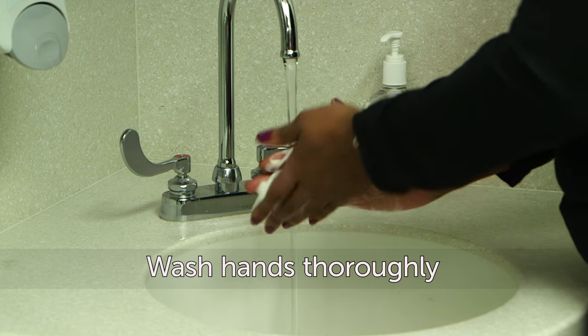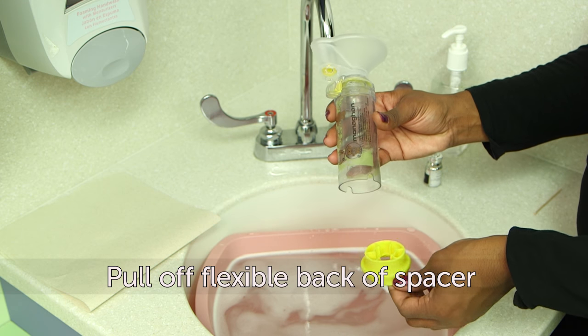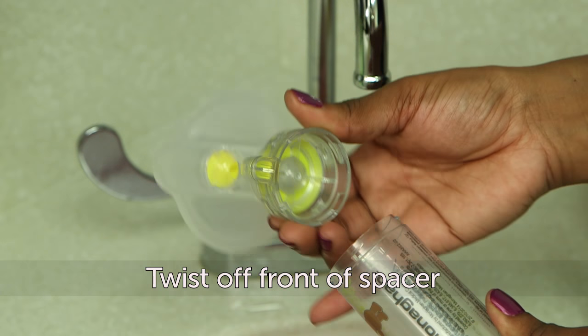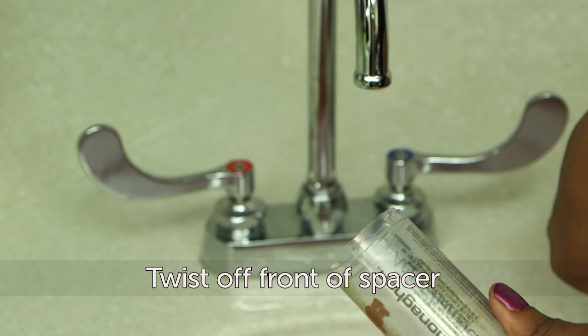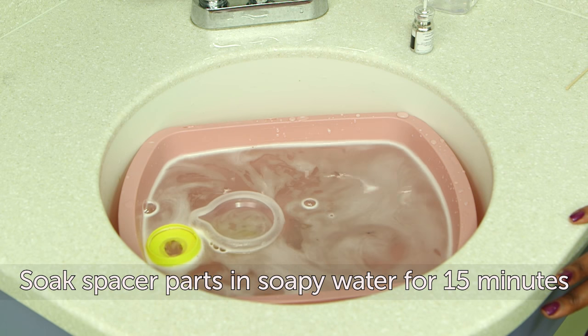First, wash your hands thoroughly. Next, pull off the flexible back of the spacer where the inhaler goes, then twist off the front part of the spacer. Soak all parts of the spacer in slightly soapy water for 15 minutes.